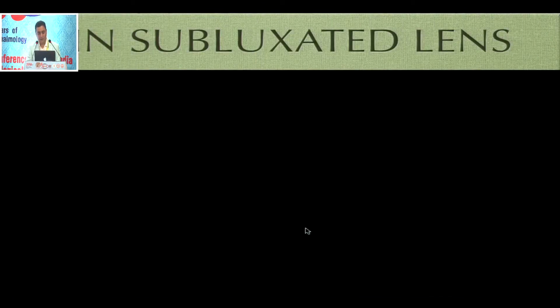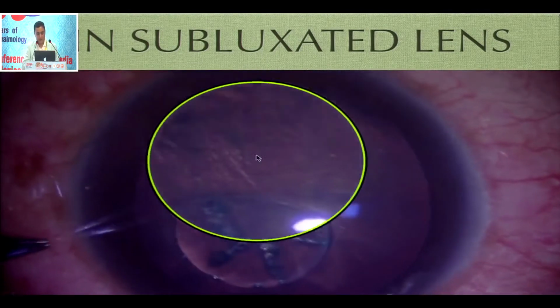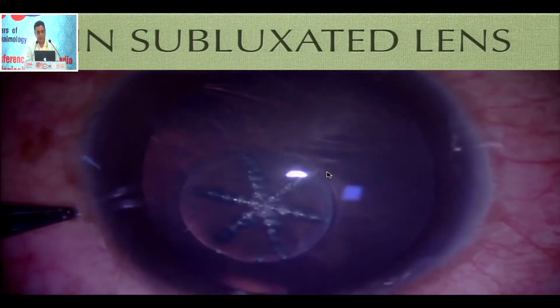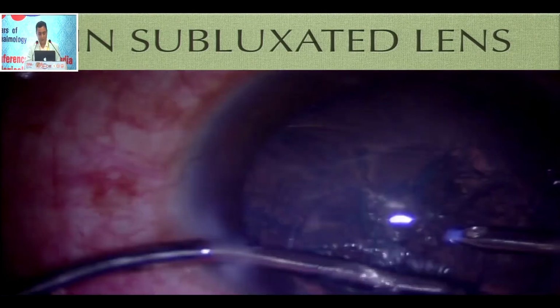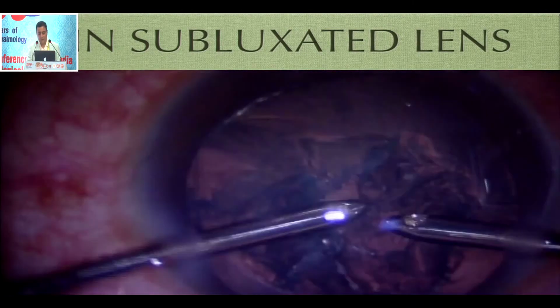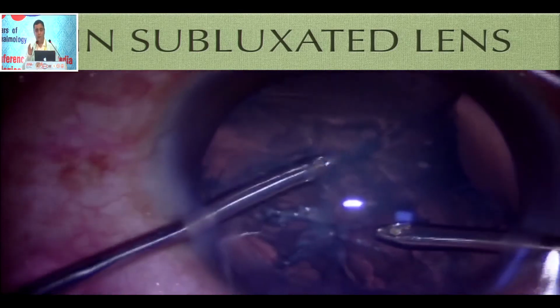Let's see how it behaved clinically. You can see the small rexis, you can see this area, and this is the area of subluxation. That's inferior, okay? Nothing to worry, soft cataract, young boy, this is all fine. So I'm going ahead, okay, removing the rexis, doing a bimanual IA, and I'm really not worried because there's no donesis. Now I want you to see the behavior of the bag.